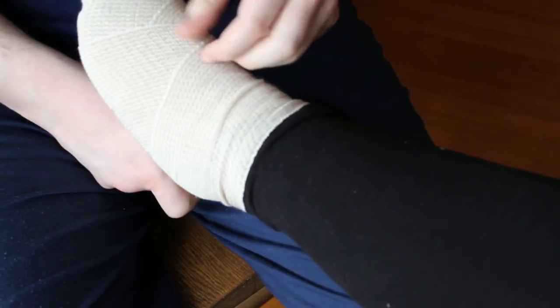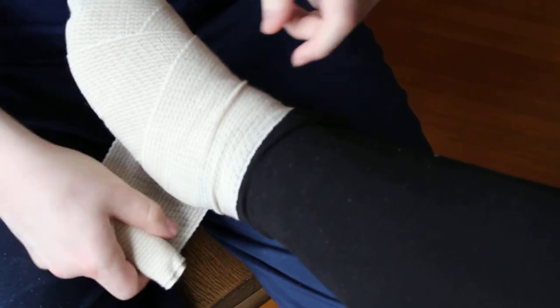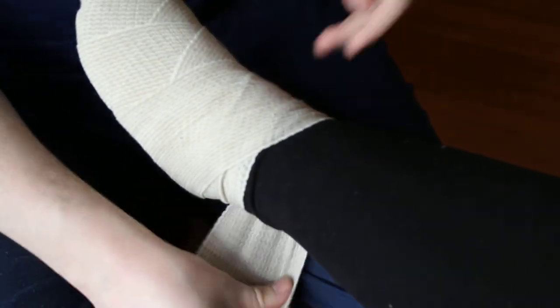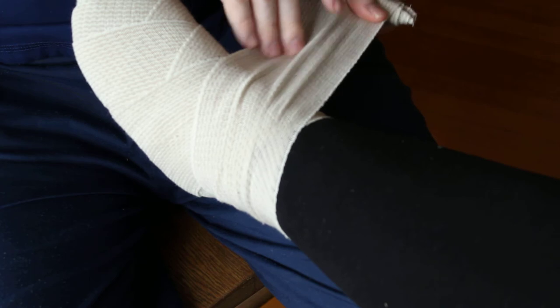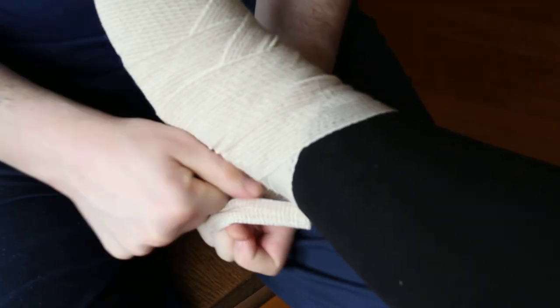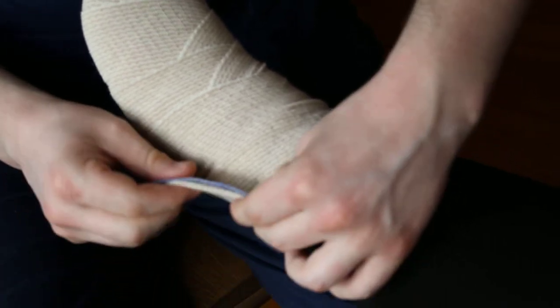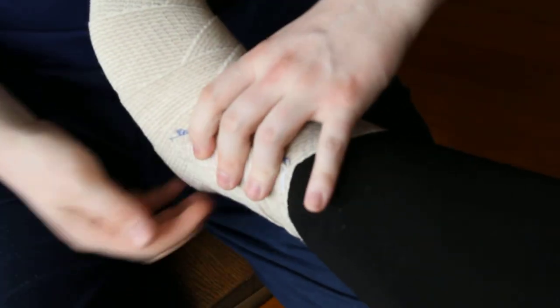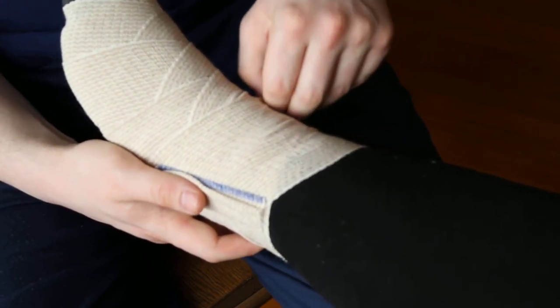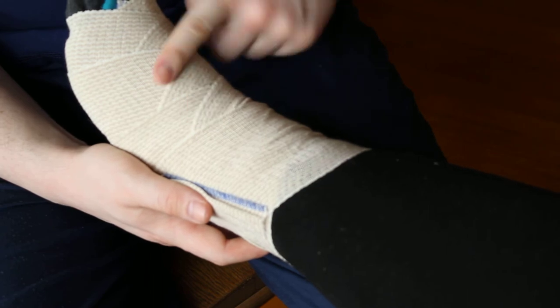This is the best way to wrap an ace wrap. It's the most effective at decreasing swelling and stabilizing your joint. This is really good if you have heart failure and you have swelling in your lower extremities. You should take this off when you go to bed and replace it in the morning. At the end you should have a cross pattern all the way down your foot.